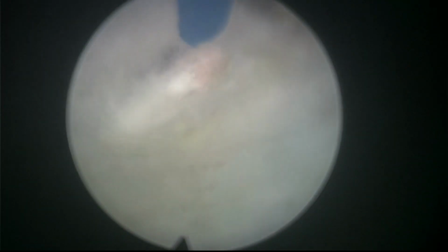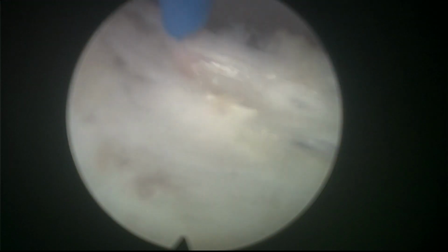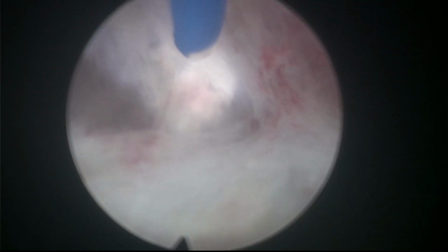My feeling with the normal classic holmium is that often the explosive nature of the laser will open up the vessels, and there must be some kind of spasm of some of the vessels. So initially, this spasm will avoid bleeding, but then after some minutes, these vessels will relax and bleeding will start. So you have to often review the surface you have treated.